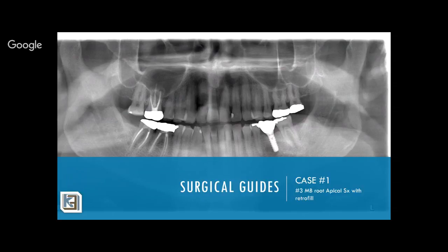Okay, here's a related question from Dr. Ryan Rupert. I have trouble visualizing small or calcified canals on my CBCT machine. Any tricks or settings to best visualize small anatomy?